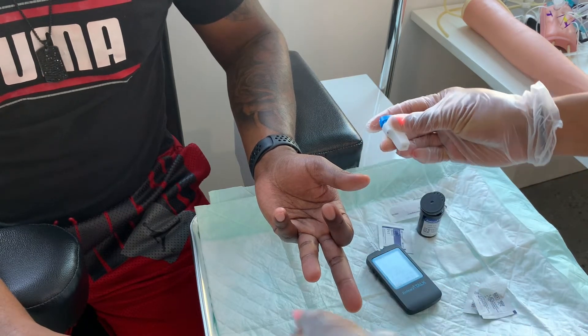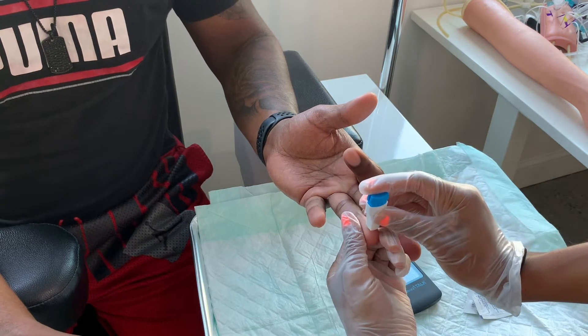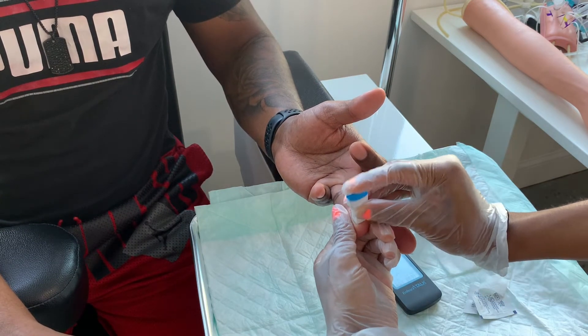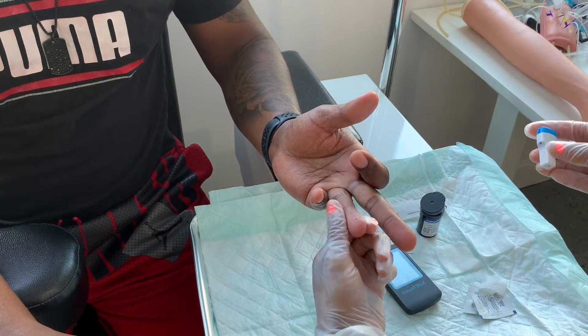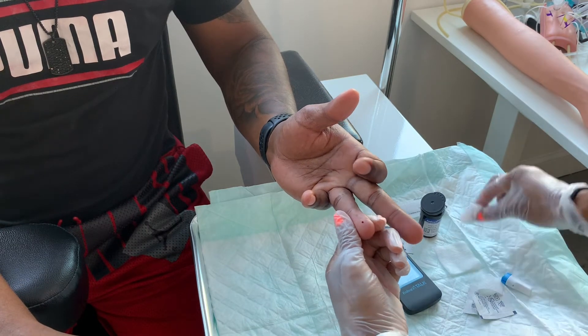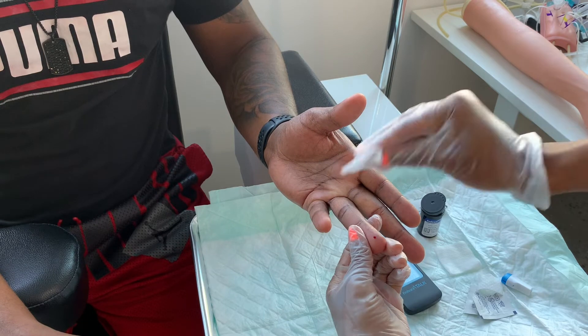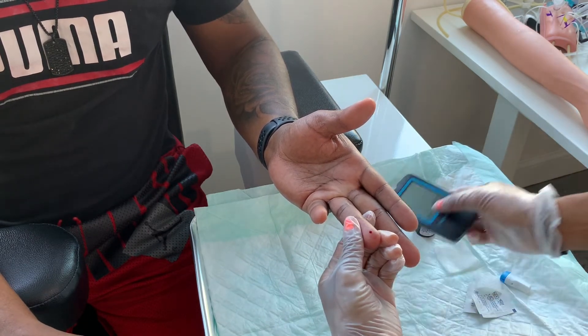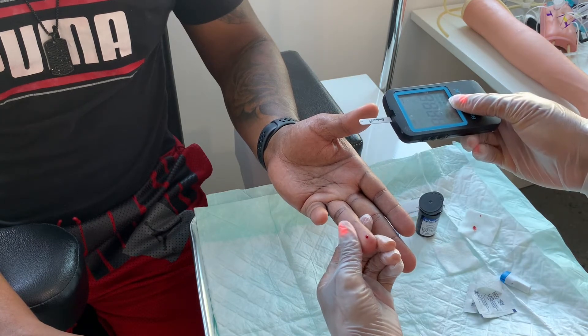You have your lancet. Your lancet is a needle which is used to pierce the person's skin. Apply pressure. Once you pop the needle into the person's skin, you're going to go ahead and squeeze. Wipe away the first drop just to get the alcohol away, just in case there is any, which could contaminate the test.